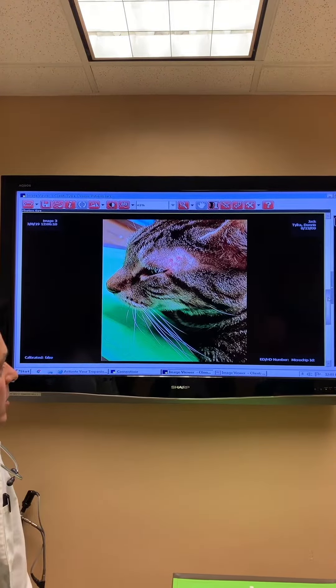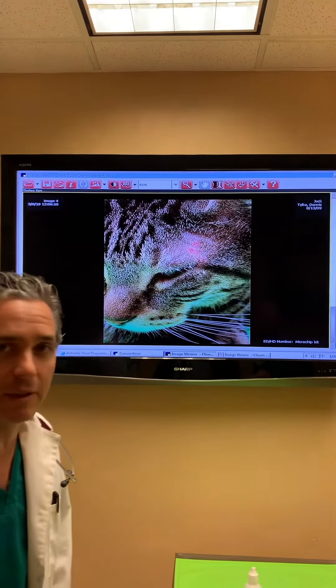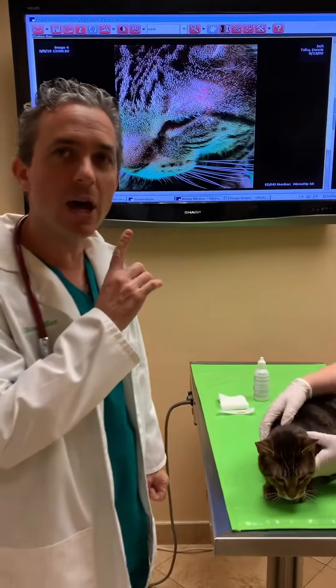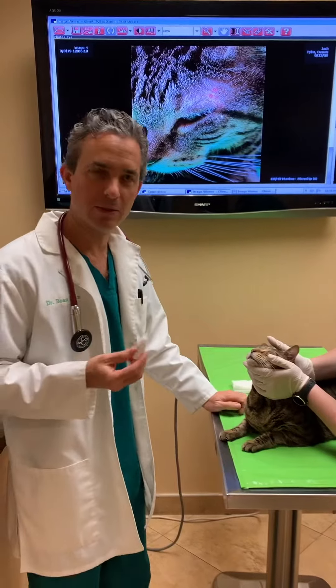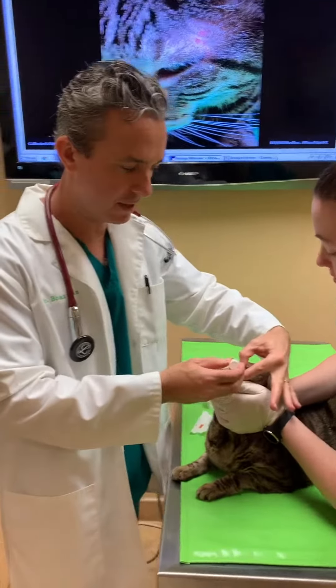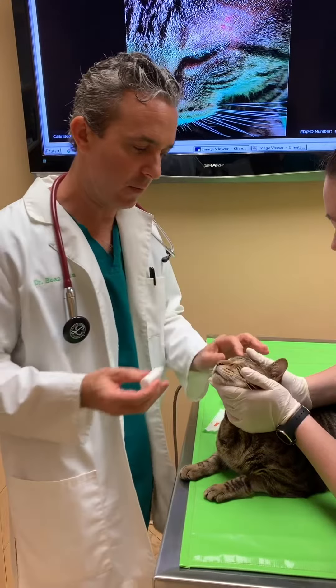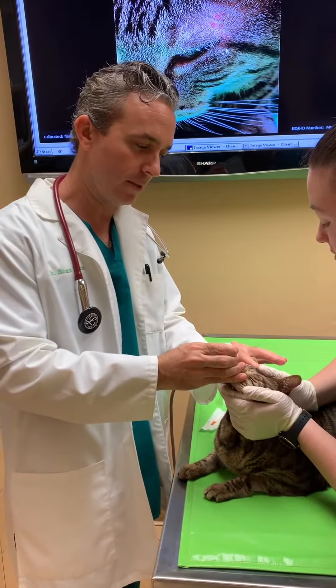Here you can see the wound above the left eye, and we're going to evaluate this carefully because we want to make sure that his eye is not scratched. The first thing we're going to do is give him an eye drop called atropine. This drop opens up his eye so that we can evaluate it as well as possible.